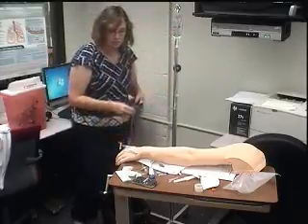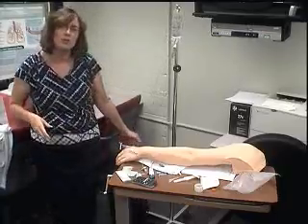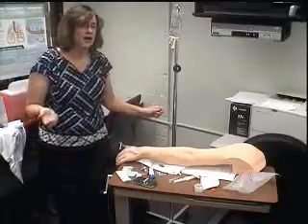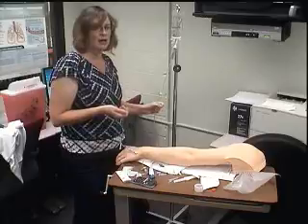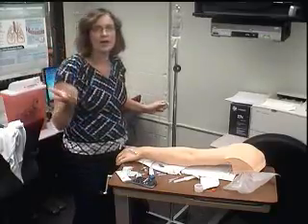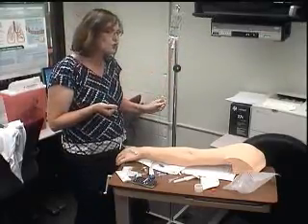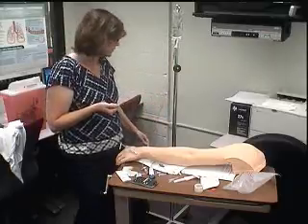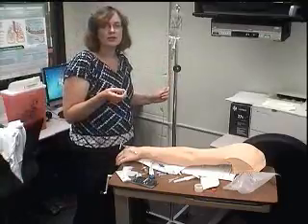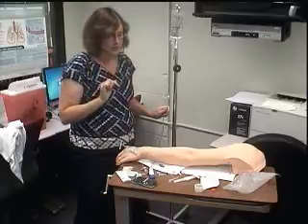And most of the time we use pumps, but you still should know how to count drops in case there's no pump available. ER, OR, you might not have it right away. If you're on an ambulance, you might not, obviously. If the power goes down and you're, I don't know, Hurricane Katrina, you probably are going to be using things like this, where you're just counting drops. So you do still need to know how to count drops. It's not something that we're just completely saying, oh, we always have pumps. Now the pumps, I'll show you in class how the pumps work. All pumps are different, but you just program the numbers in.